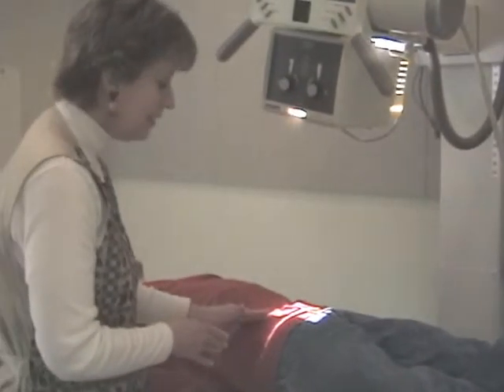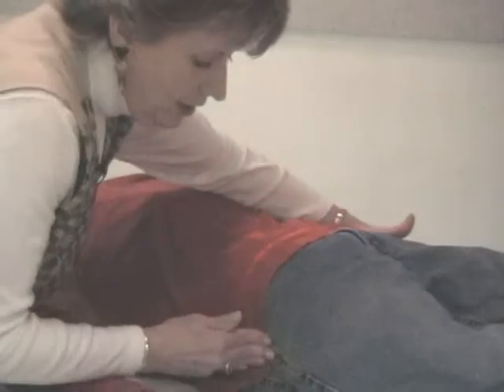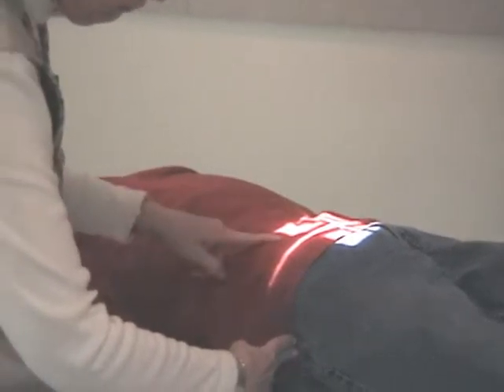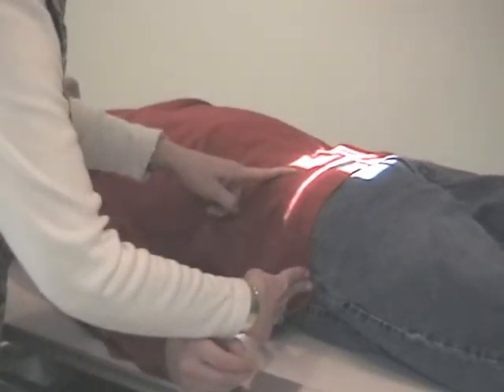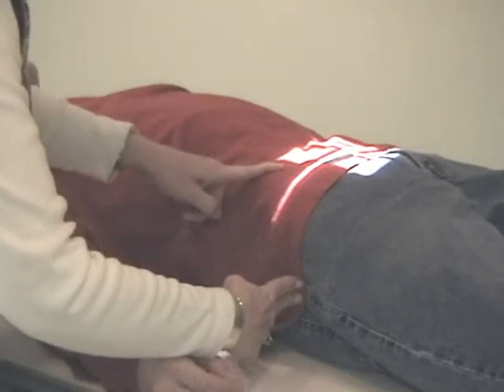In a gown, you'd probably be able to see the pubic bone. But for demonstrations, I'm going to double check my positioning. This was just a guess. I cannot tell for sure where his upper border of the pubic bone is. So I'm going to find his trochanters. There's Larry's trochanter. I found it fairly easy, and if you'll recall, it is at the level of the pubic bone, right there. So I can use my ASIS and take a look. I used an alternate reference source to confirm that I was halfway between the level of the upper border of the pubic bone and the ASIS. So I'm very happy with the centering.